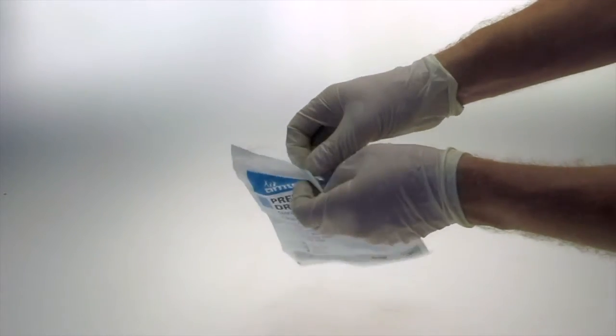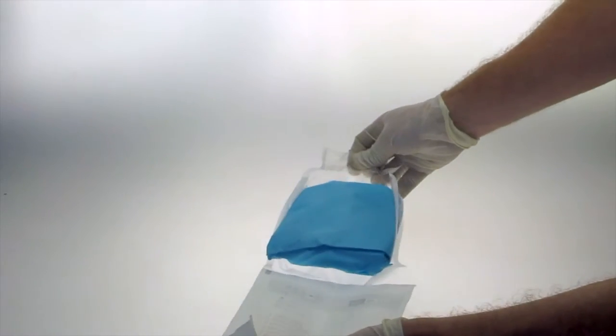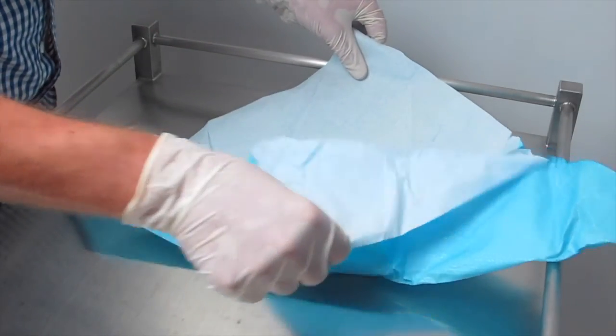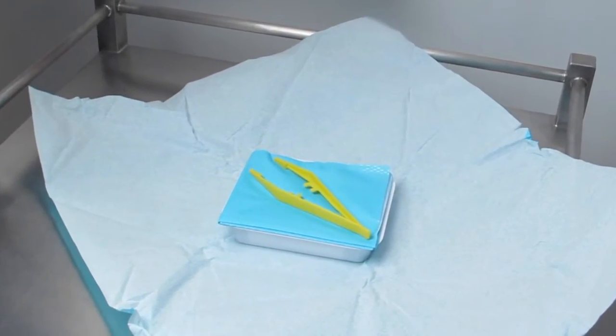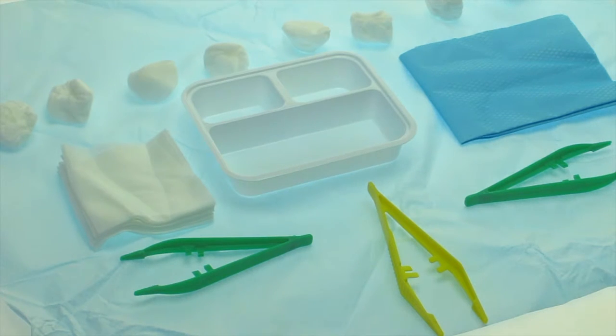The sterile plastic pouch is easy to peel open. It contains a tray, eight gauze balls, five non-woven swabs, three plastic dissecting forceps, one wrapping sheet, and a plastic field.